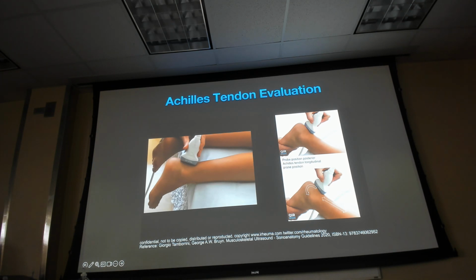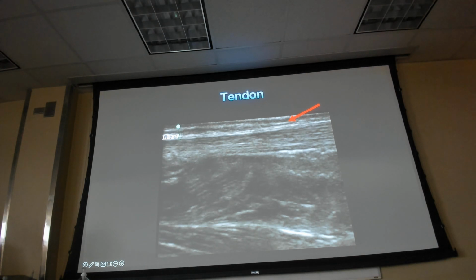Anyway, it's pretty awesome. So usually we'll look at the Achilles tendon, we'll look at its insertion right at the calcaneus, and we'll kind of follow it up, and we'll follow all the way up till it kind of disappears in like the soleus muscles and things. It's really awesome, and I'll show you how easy it is once you get oriented.